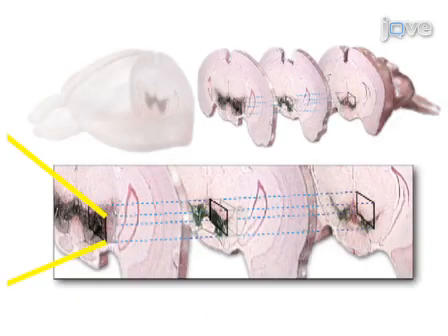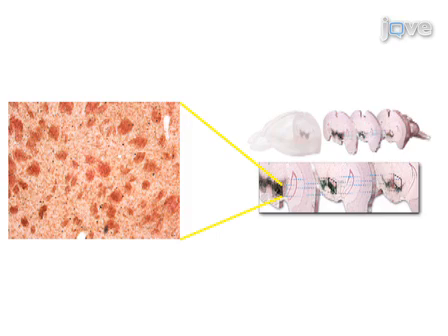Ultimately, results can be obtained that show the biodistribution and effects on brain chemistry and cell morphology occurring as a consequence of therapeutic and diagnostic nanomaterial treatment through magnetic resonance imaging and spectroscopy that are co-registered to histological analyses.